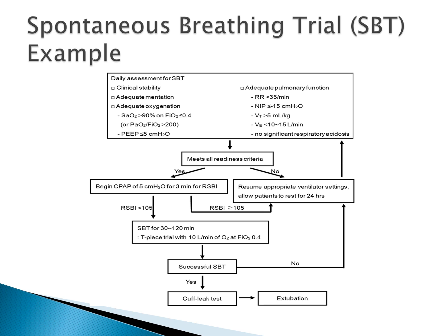And again, just to quickly review, even though it is described elsewhere in this presentation, rapid shallow breathing index: the numerator, the top number, is the, if you will, quote unquote, spontaneous respiratory rate, and the denominator, or the bottom number, is the tidal volume expressed as a decimal. So if the patient has a spontaneous breathing rate of, let's say, 25 per minute, their tidal volume is 500 or 0.5, that will be an RSBI of 50, or 25 divided by 0.5.